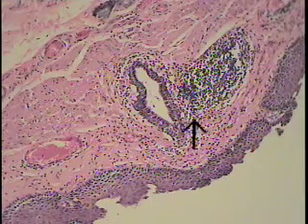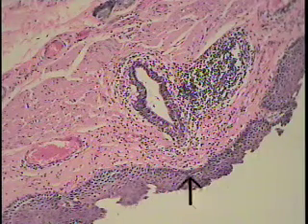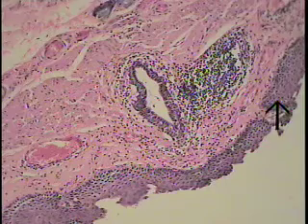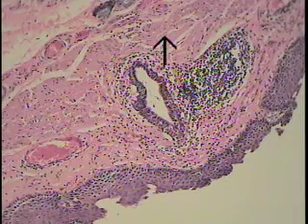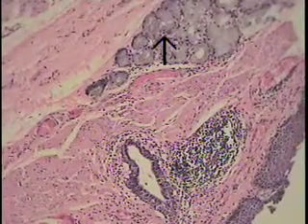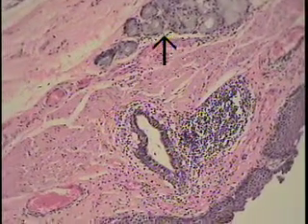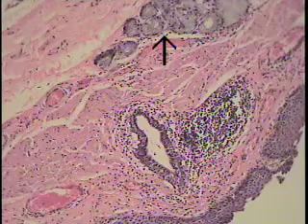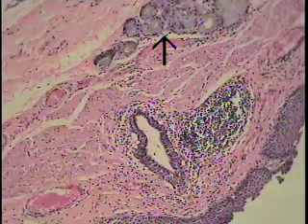Your next exercise is to return to slide number 5, the esophagus, and examine the connective tissue underlying the epithelial layer lining the esophagus. Remember that non-keratinized stratified squamous epithelium, for blood vessels of various types, and identify various sized vessels. Most of them will be small, but you will see venules, capillaries, and smaller caliber veins in this particular location, just to get the practice of differentiating one from the other.